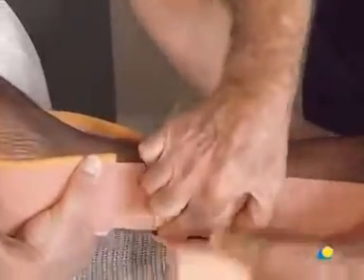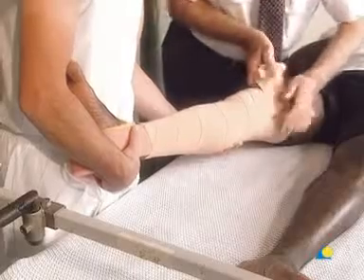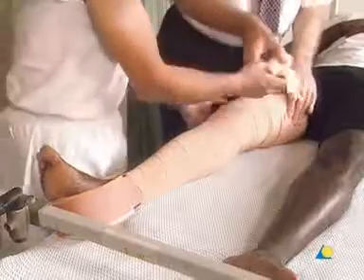Starting four finger widths above the ankle joint, a circular bandage is wound proximally with moderate tension towards the groin. It is crucial that there be no wrinkles in the bandage. A second bandage ensures that the elastoplast is secured as far as the groin.